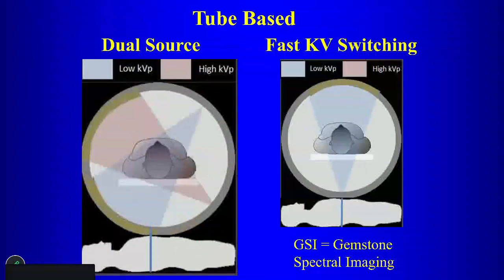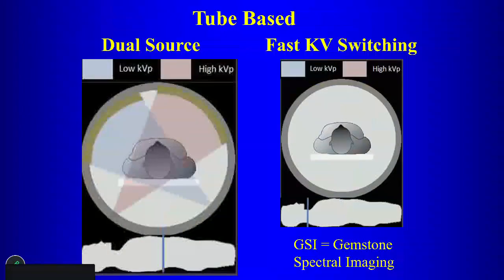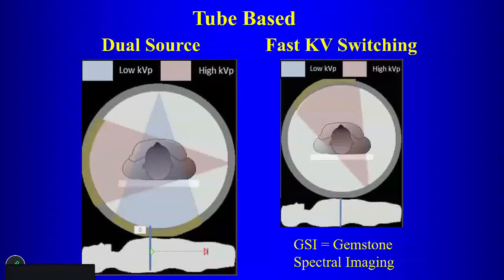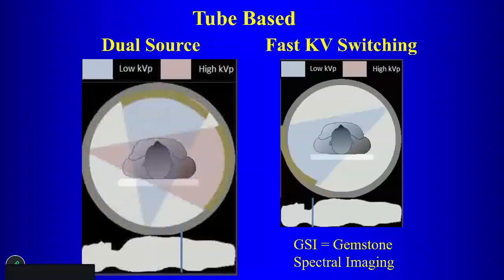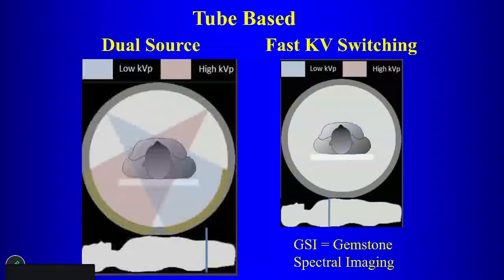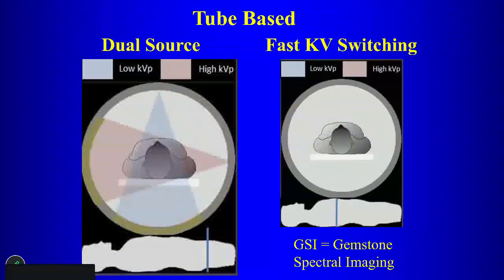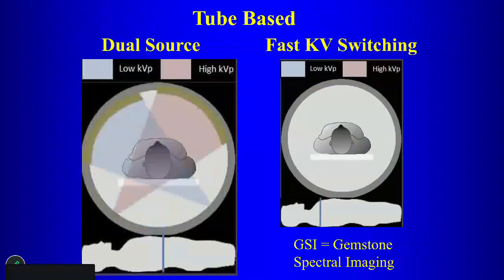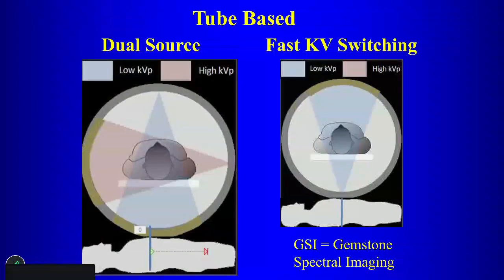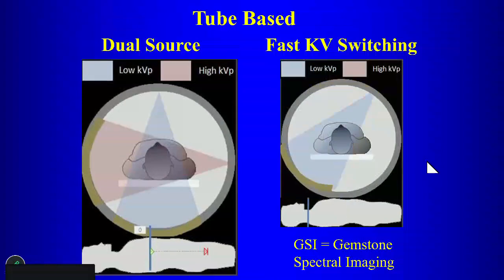Post-thrombectomy for the head? Hmm? Characterizing renal stones. So if you want to characterize, let's say for gout, or the composition of renal stones, it's very important to get those different energies, and it optimizes it if you have the two X-ray tubes at different energies. Do we do that in our protocol? I don't know, because I don't do those, so ask. It's a good question. But for chest and for everything else, we don't have to, because it's photon counting.